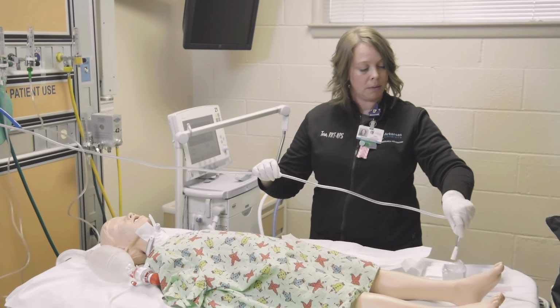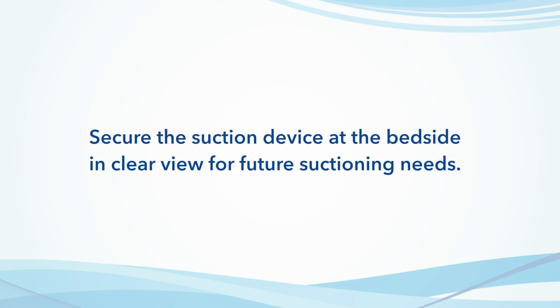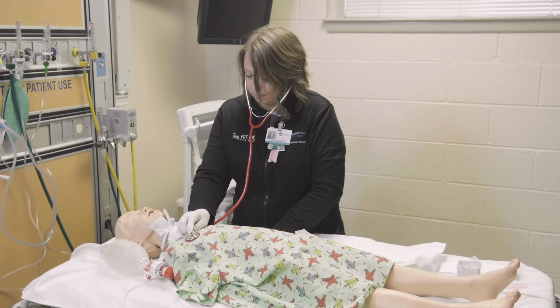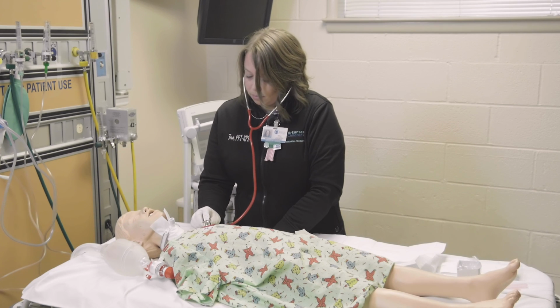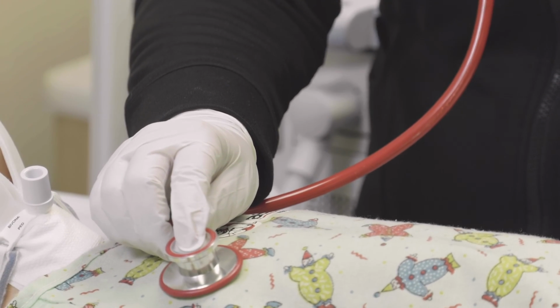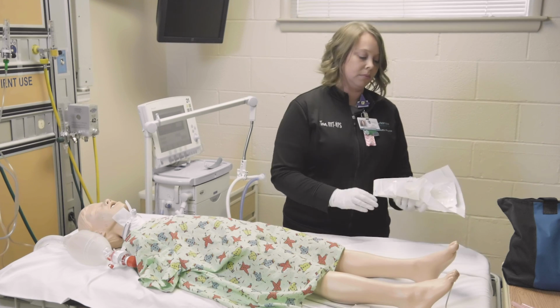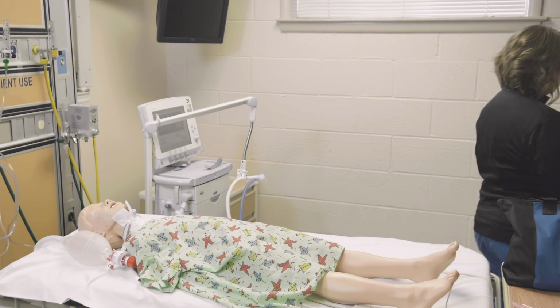Flush the connecting tubing with sterile water or saline solution. Secure the suction device at the bedside in clear view for future suctioning needs. Assess the child's cardiopulmonary status and breath sounds to detect any pertinent changes after suctioning. Discard supplies, remove personal protective equipment, and perform hand hygiene.